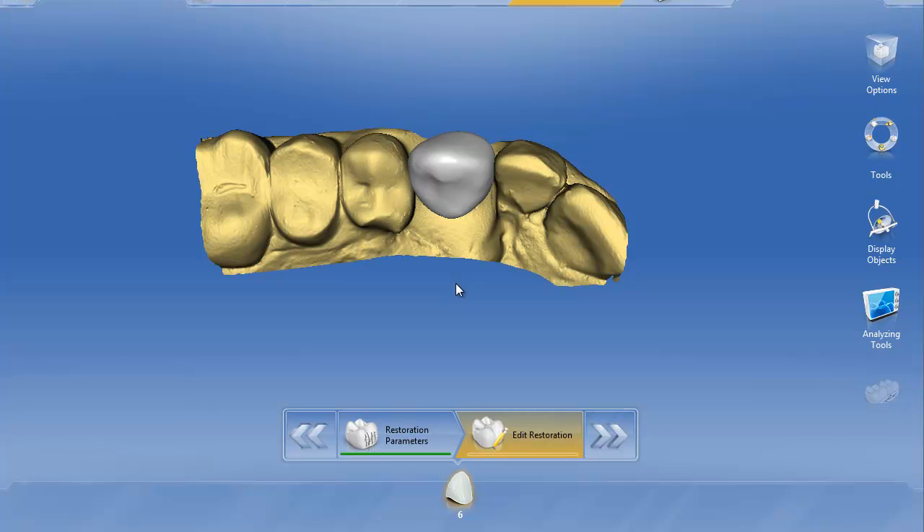In this video I'm going to show you another way to make a screw access hole for a screw retained implant crown using the InLab 4.0 software. A lot of you are using the Shape 2 directional tool and that works pretty good, but a lot of us have missed the really sharp margins of that screw access hole we can get with the 3.8 software and the Shape tool.